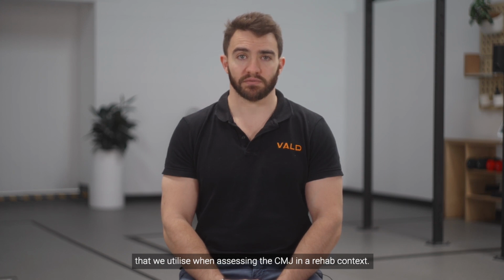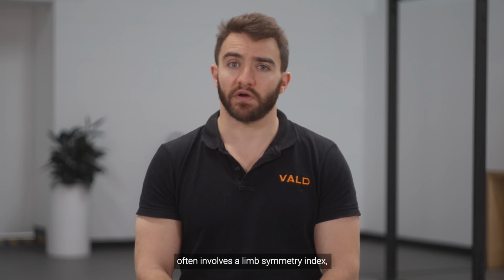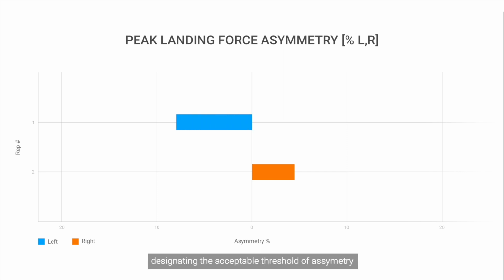rehab context. In rehab, the standards for progression from one phase to the next often involves a limb symmetry index, or an LSI. An LSI is a chosen value typically between 5 and 10%, designating the acceptable threshold of asymmetry between limbs that we must meet in order to progress from one phase of rehab to the next.